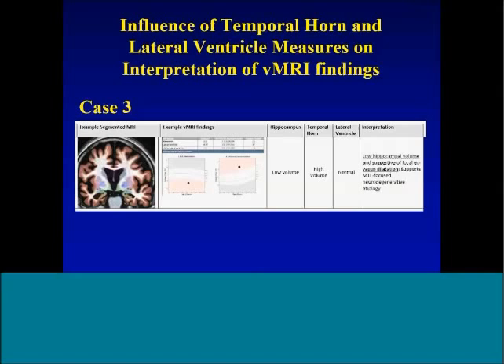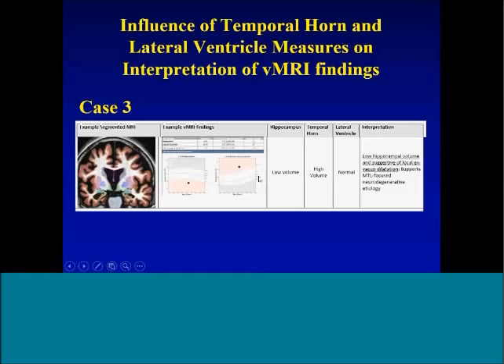Case three is a more classic picture for early memory loss in Alzheimer's disease — a fairly spared lateral ventricle at the 83rd percentile, but clearly atrophied hippocampi and expanded temporal horn, with the entorhinal cortex quite thin. The volumetric report shows a very small hippocampus more than two standard deviations out of the range of normal, supported by the expanded temporal horn, while lateral ventricles are still normal. This looks like a medial temporal focused neurodegeneration — possibly caught at a stage where global atrophy has not yet hit and the pathology is more localized to the hippocampus.